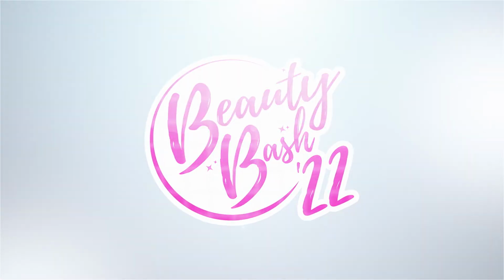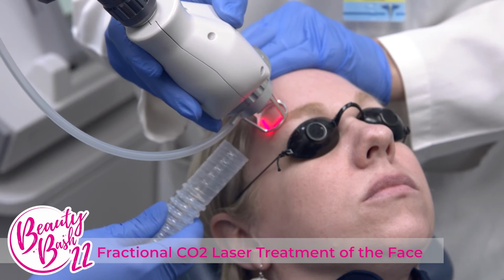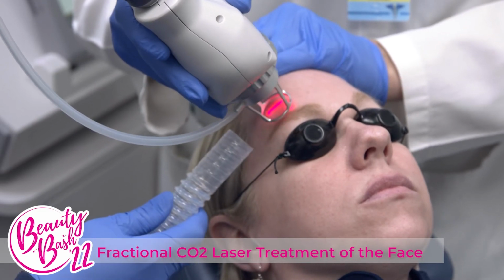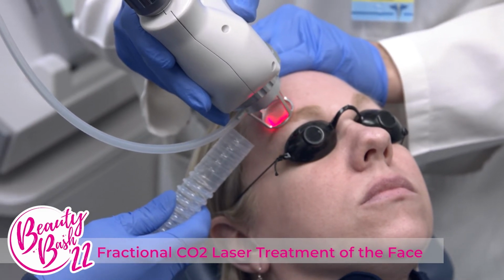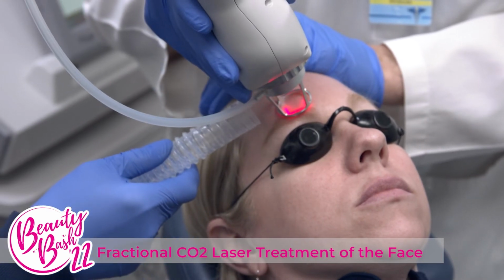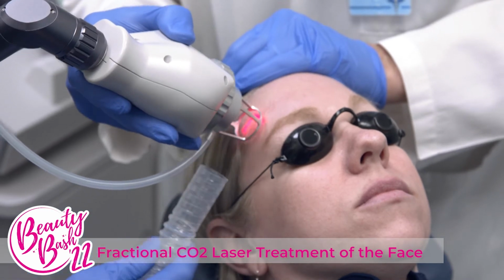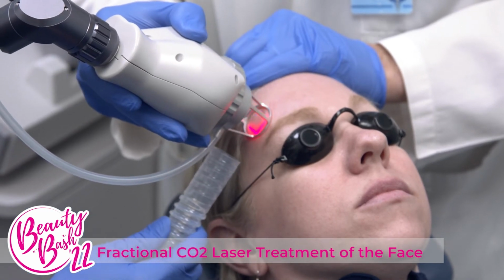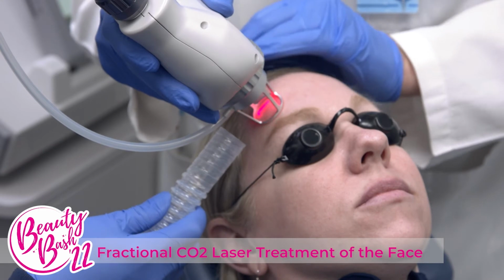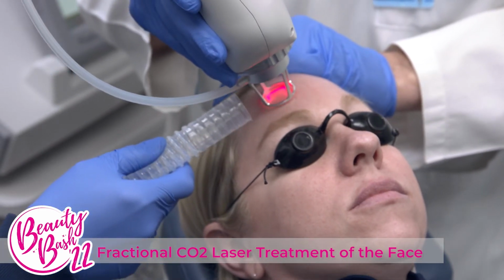Lasers have been used to resurface facial skin for over 2 decades. The first lasers that came into regular use in the 1990s would fully ablate layers of skin, leaving a raw superficial wound, somewhat similar to a scraping injury on a knee or elbow, but with no bleeding. About 2 weeks were required to achieve complete healing, and the new skin was pink and delicate for several months. Pain, infection, and scarring were always possible with this type of treatment.